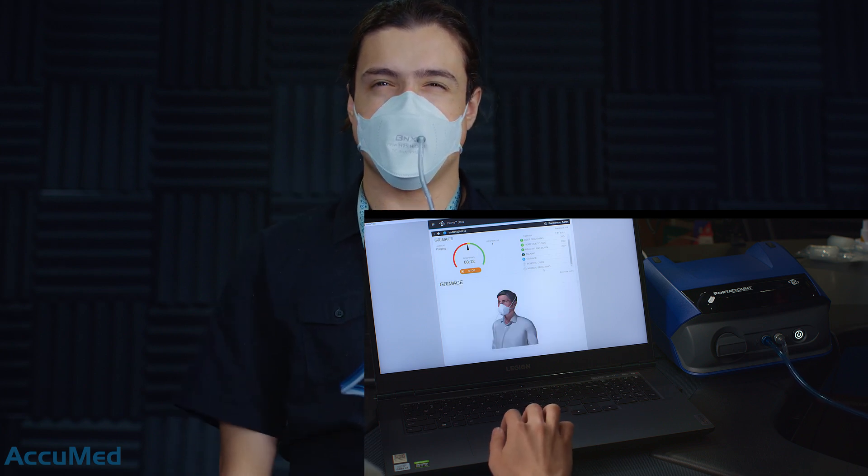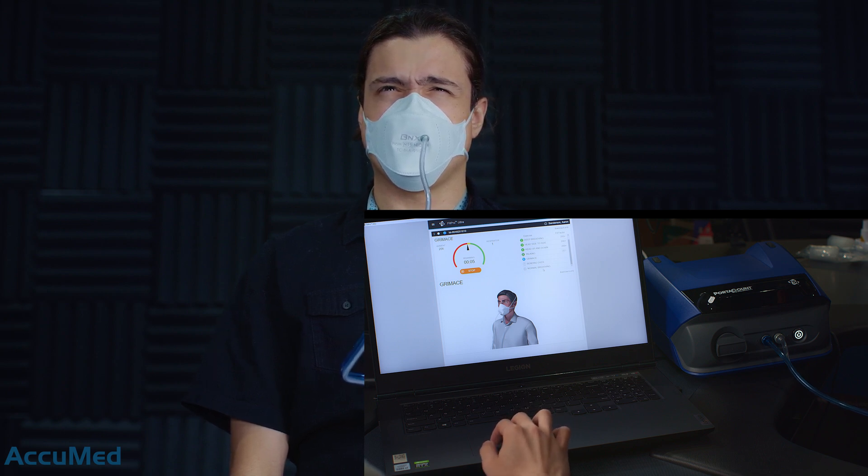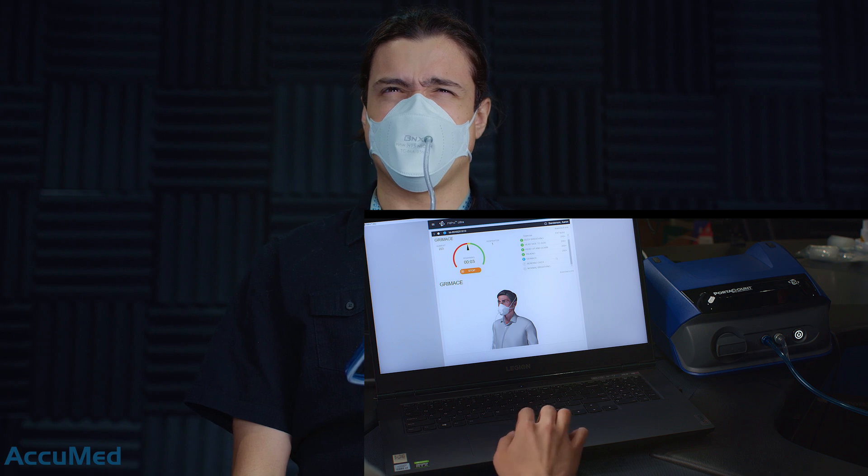Next exercise. For this exercise, we are trying to break the seal around the mask. We are doing this on purpose — intentionally breaking the seal around the mask.